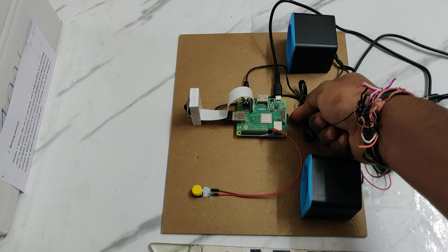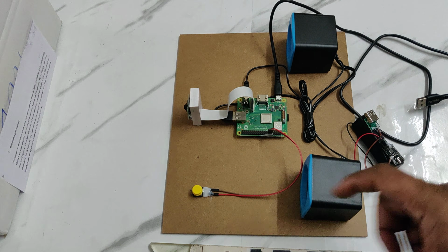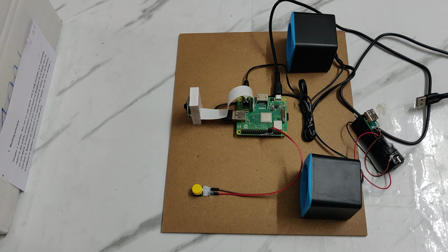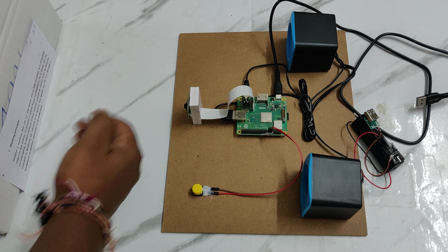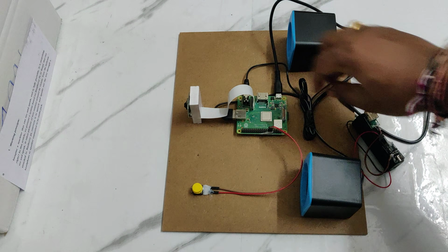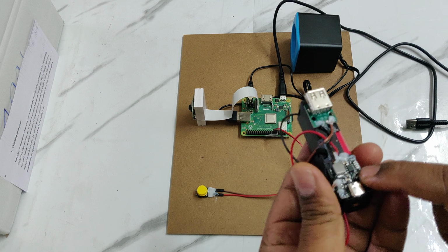This is the memory card we have inserted into this. Initially we load the operating system into it, and then we write the instructions to read the input from this button and control the output and the speakers. So let us check with the demonstration. Keep the text around this much distance, nearby around 7 to 8 inches, with more lighting on the paper and less lighting from the camera side. Next, this is the power bank we are using, which is the rechargeable battery.